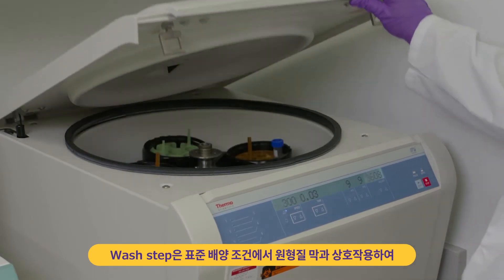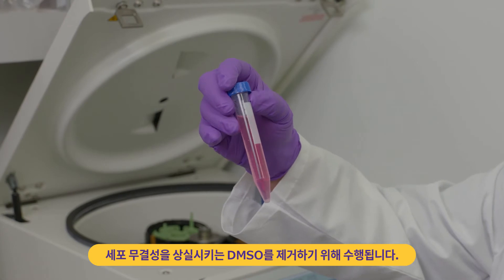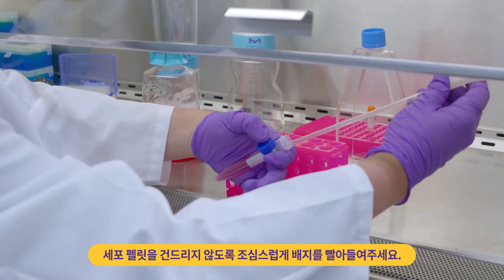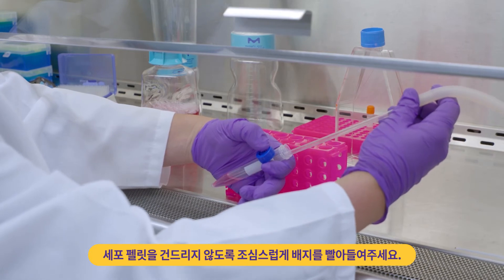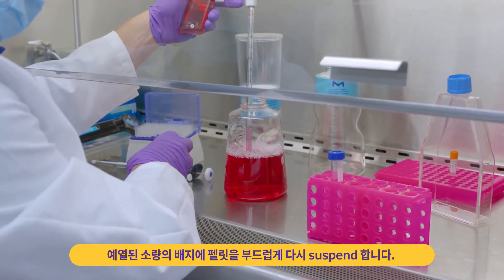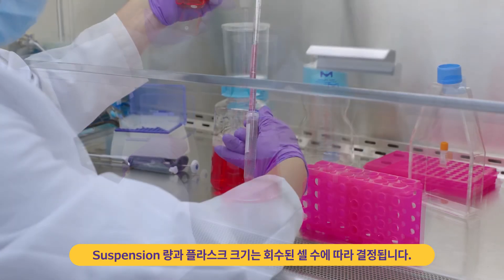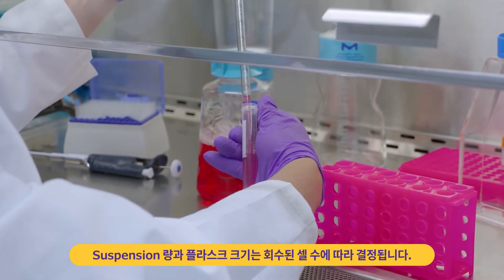The wash step is performed to remove DMSO, which under standard culture conditions will interact with the plasma membrane causing loss of cell integrity. Once complete, carefully aspirate the medium, making sure not to disturb the pellet. Gently re-suspend the pellet in a small volume of pre-warmed culture media. The choice of suspension volume and flask size is determined by the number of cells recovered.